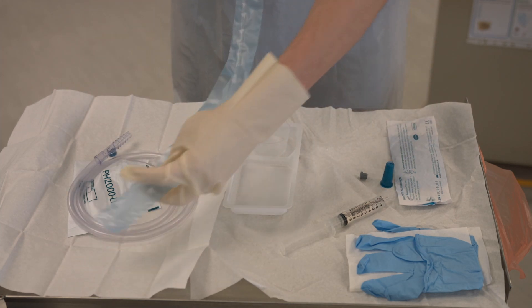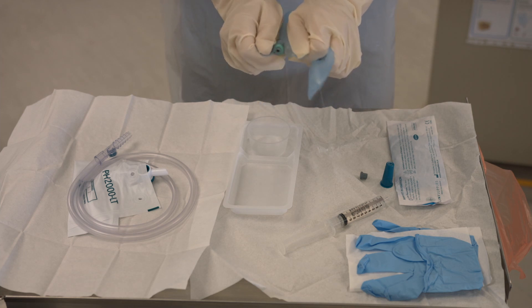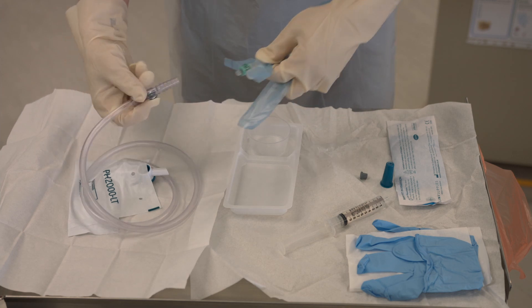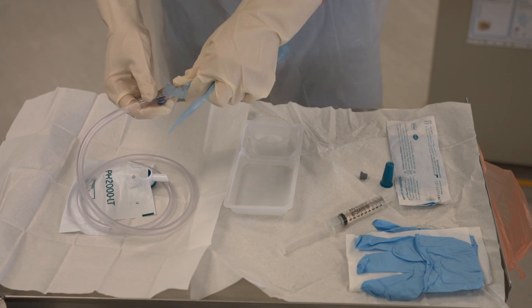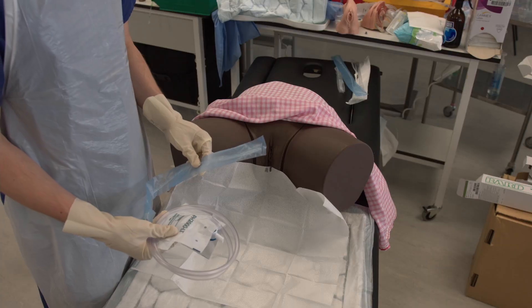Then open the back end of the perforated bag for the catheter. At this point it is helpful to hold the front of the perforated bag as well to stop it waving around and becoming contaminated. Once the back end of the perforated bag is open, connect it to the catheter bag and take the whole thing over to the patient.